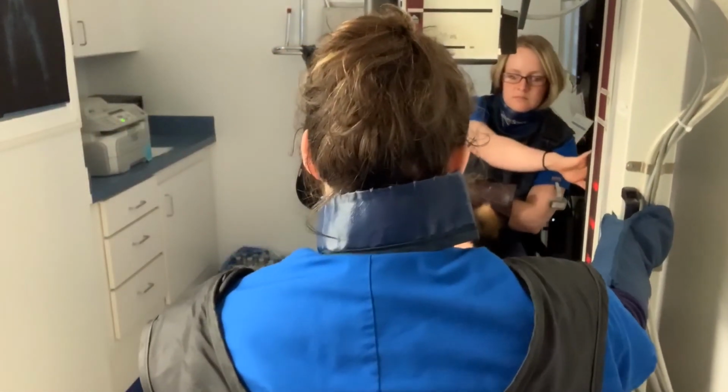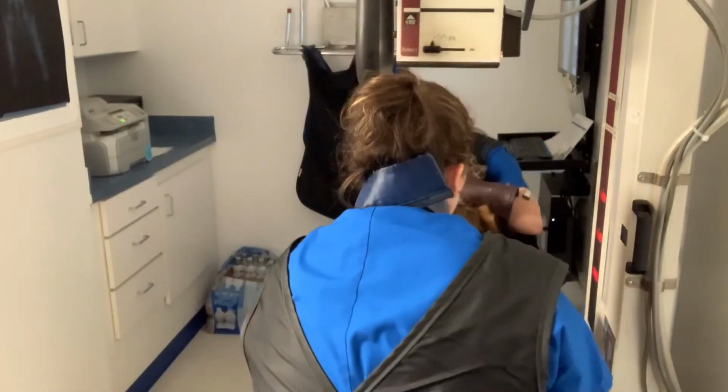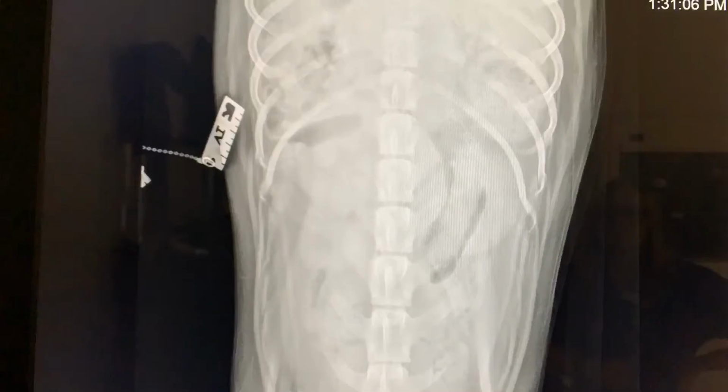If Brooks were a real case, I would choose barium sulfate as my contrast agent, 3 to 5 mL per kg for dogs over 40 kilograms, and he is 42.3. The suspension form of barium is the positive contrast agent generally used because its particles do not flocculate or separate. The barium sulfate does not settle upon standing, so the suspension should be shaken prior to use.